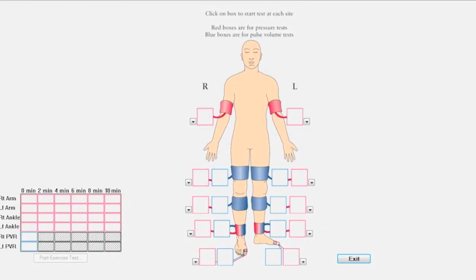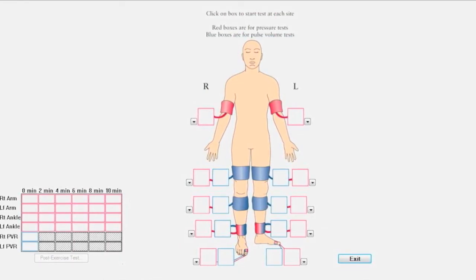The software will guide you to complete the PVR process for each required anatomical site.